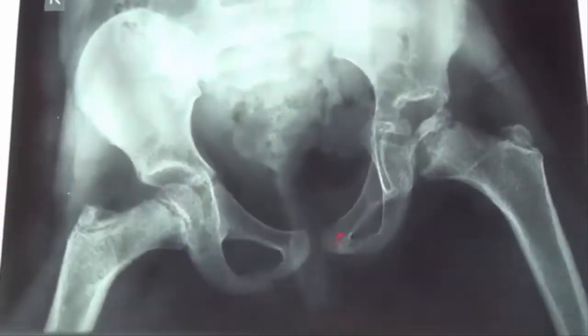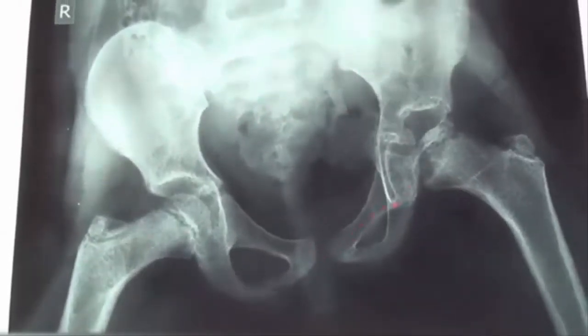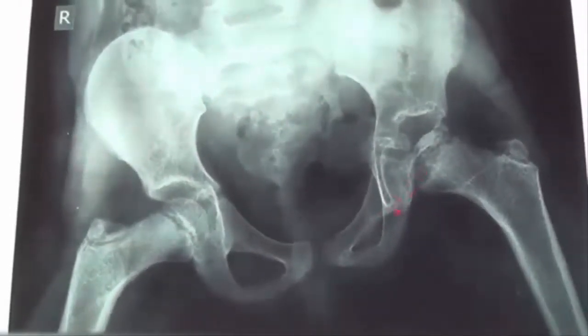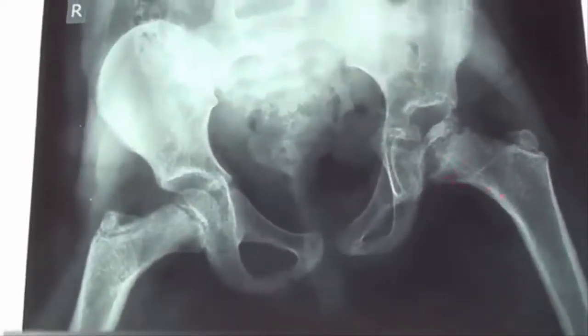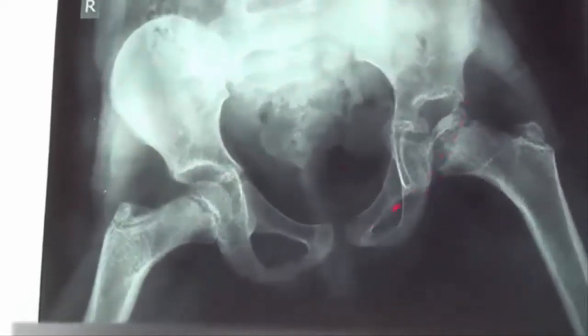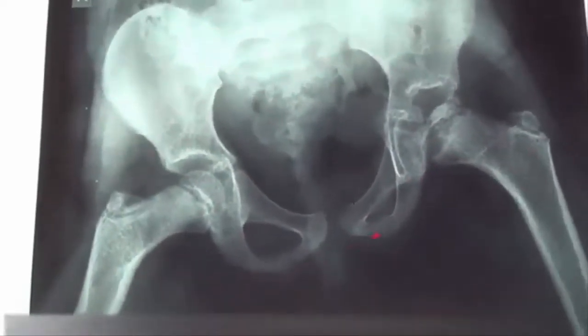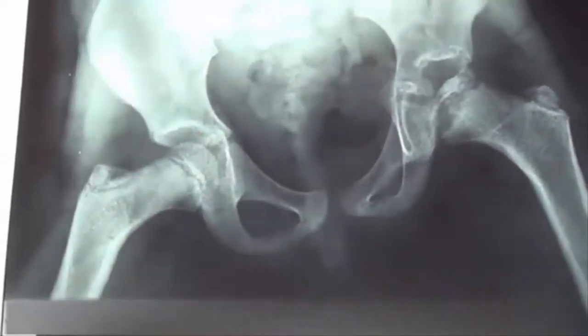So when we see that kind of Perthes disease that is really bad in the follow-up, we have to add some special positions like this one. This is an internal rotation of the hip with abduction, and you can see that if you try to do so, the pelvis tilts. See the obliquity in the pelvis, down and also up.